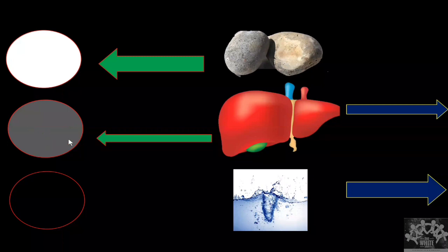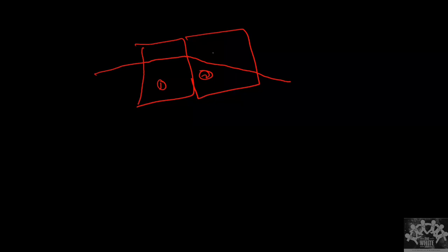Now, the reflection, as I told, doesn't depend on the density, like how we discussed in X-ray, where the tissues were attenuating the beam. What happens here is, the first thing you have to understand is, if there are two mediums and it is going from one medium to another, consider light and a glass. Normally light will pass from one medium to another medium. When it passes from one medium to another, it gets refracted. That's one thing that can happen. When the refractive index of the two mediums differs sufficiently, it will get total internal reflection.